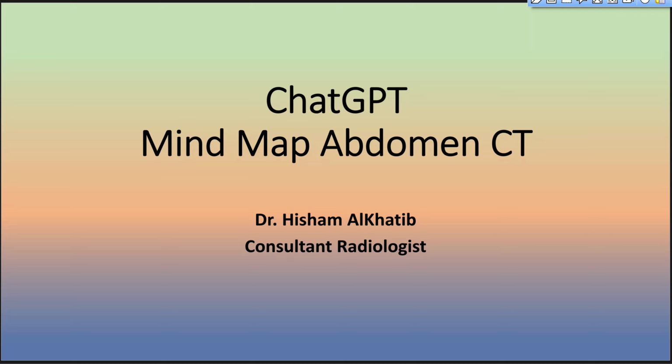This is another talk regarding ChatGPT, how it is needed for radiology training and learning. And in this short video, I will talk about a mind map for abdomen CT scan, how to read the CT scan regarding the ChatGPT guidance.